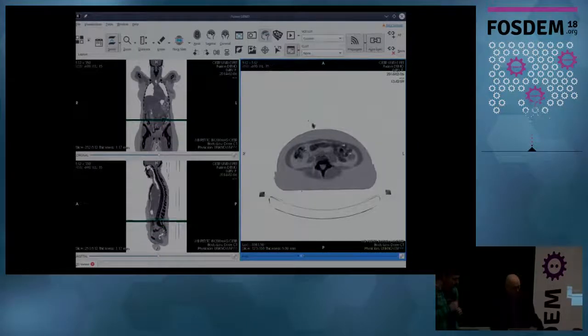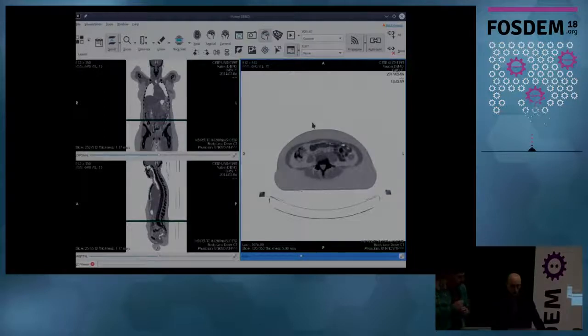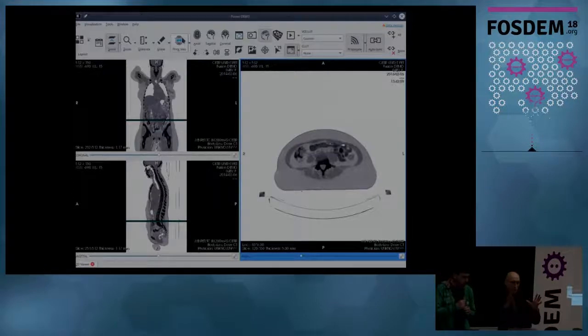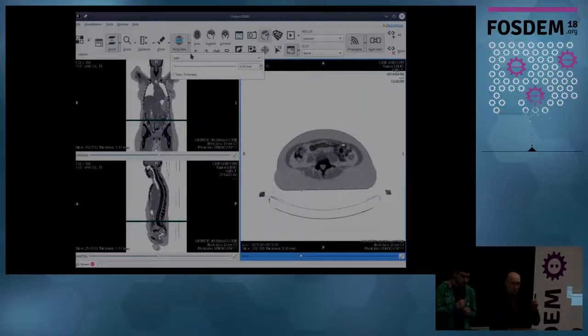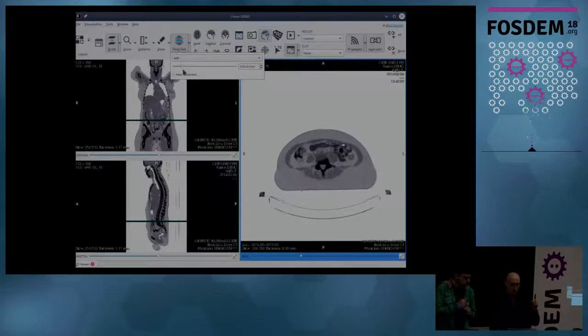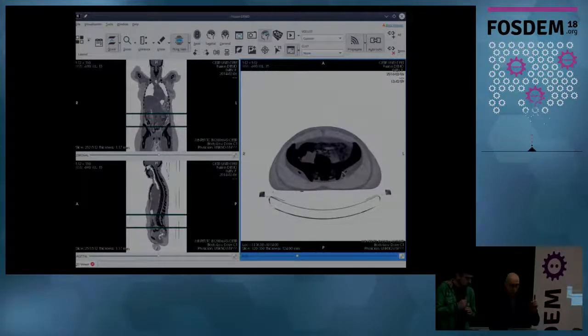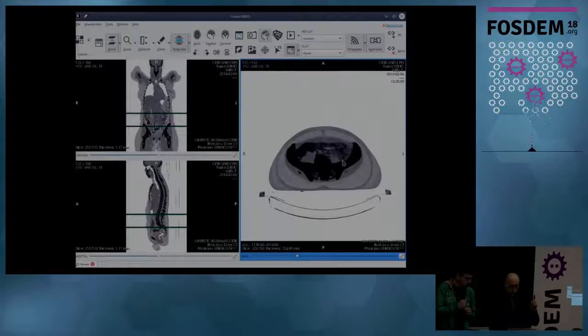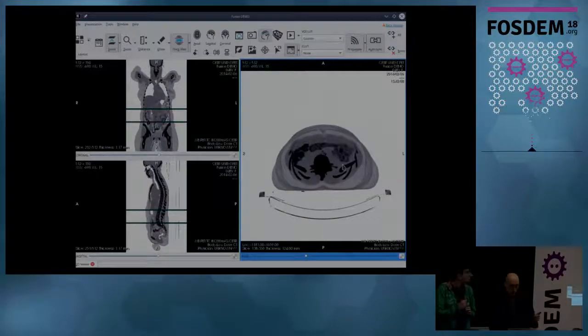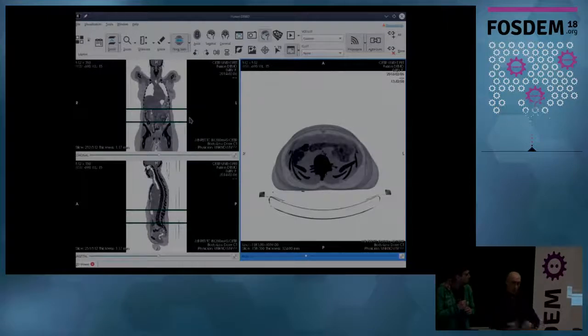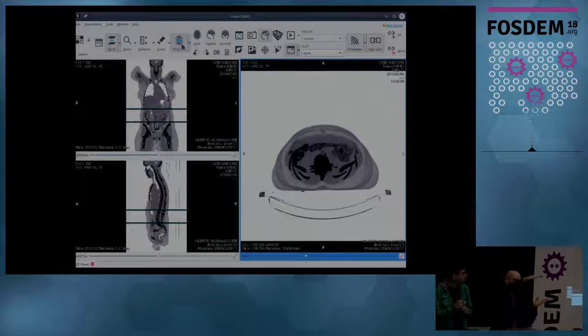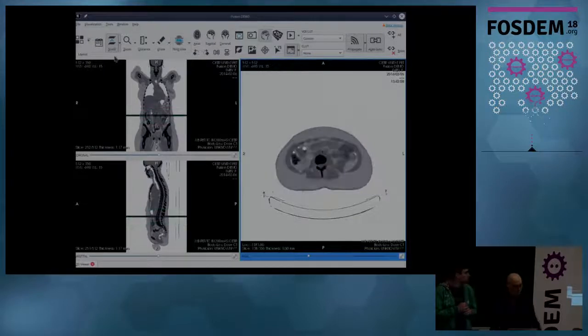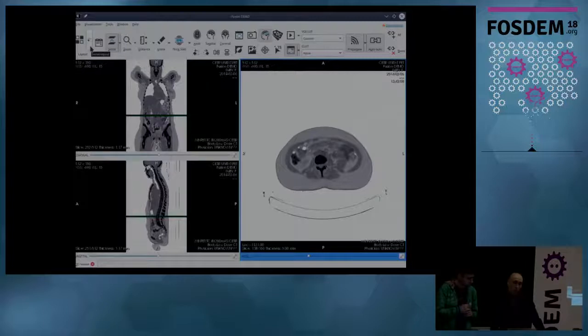What we can do is taking several slices and generate one single image which summarizes them. This is called Thick Slab. So I put, for example, 120 millimeters. And as you can see, now we see the pelvis or the ribs. And we are visualizing this thick block of images. I disabled this because it is quite CPU intensive.